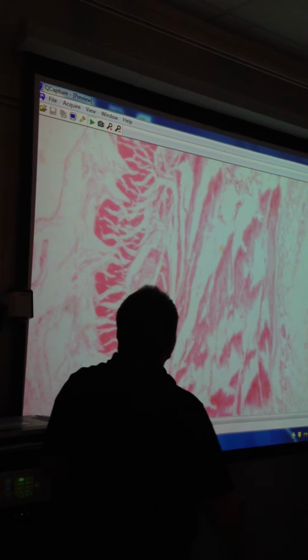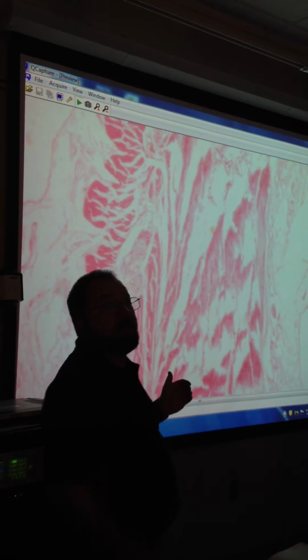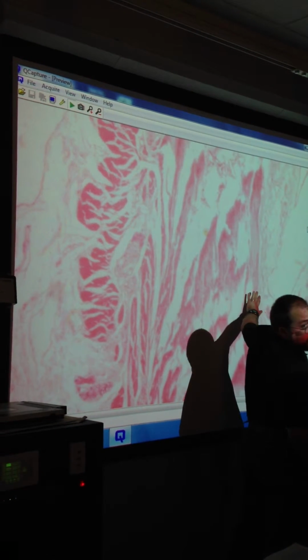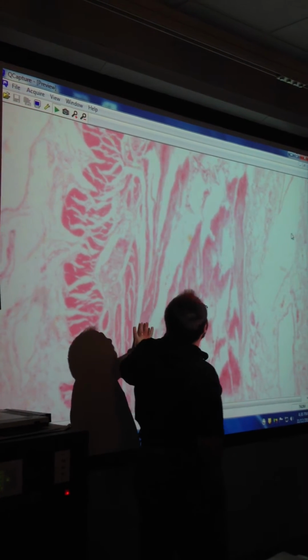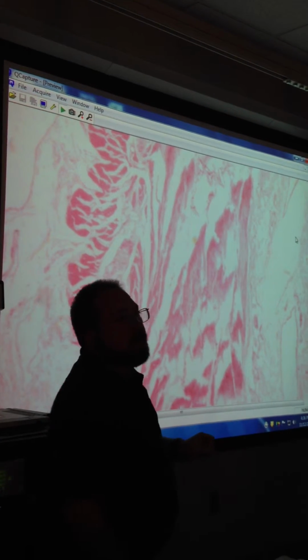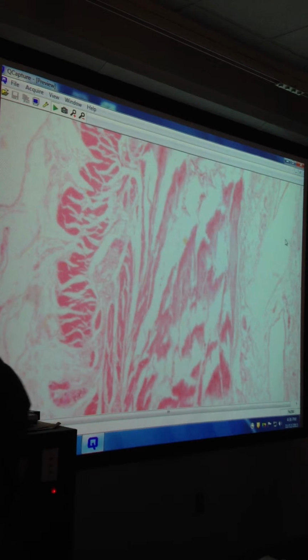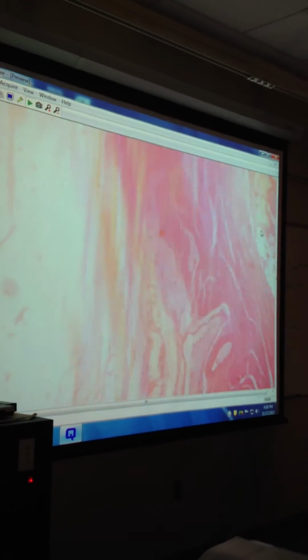All right. Keep scrolling in. It's really hard to make out three distinct layers. We do have this very wide band of muscularis externa. Somewhere in here would have to be innermost oblique. Somewhere out here would have to be outer longitudinal. In the middle here, maybe these stripes here would be middle circular. Last section.